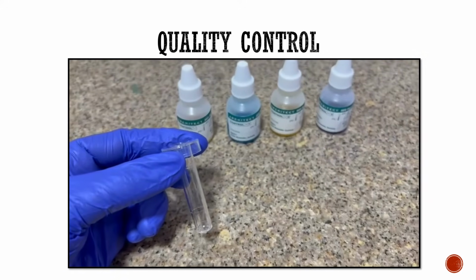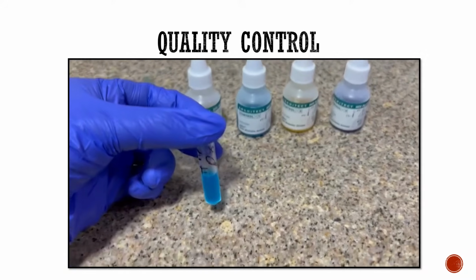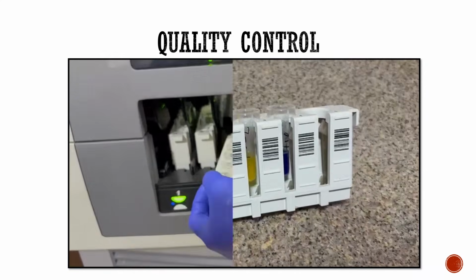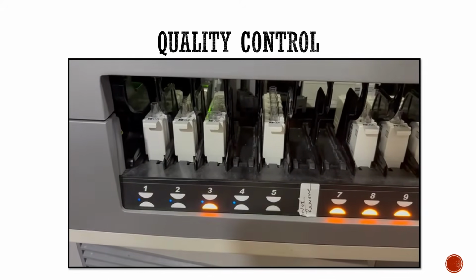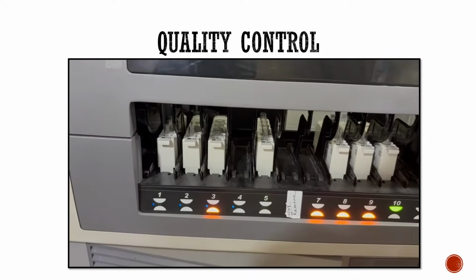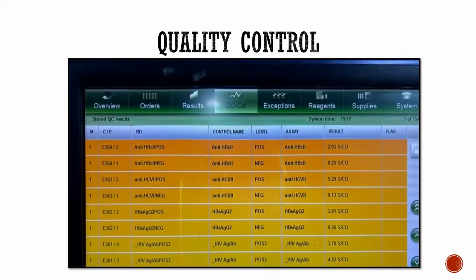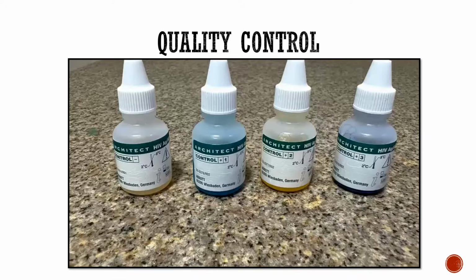We have to load the control in aliquot tubes. After loading, place them in the sample carrier, that is a barcode labeled sample carrier. Now we can load the carrier the same way as we load it for the donor samples, and the barcode reader will read the QC and the test will be performed, and this is the result after the QC. So here we can see the positive and negative controls and the result.